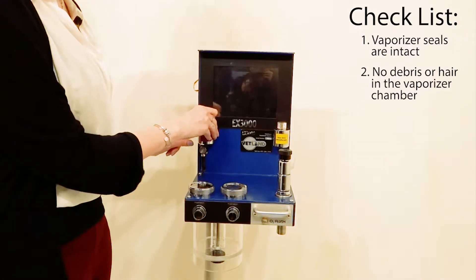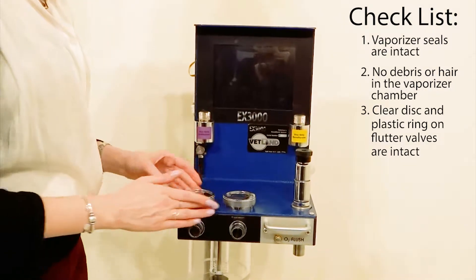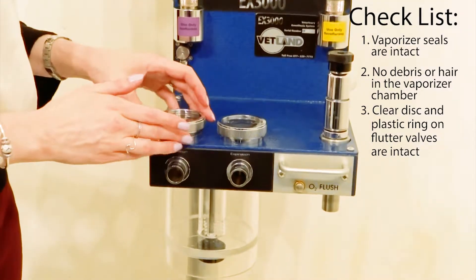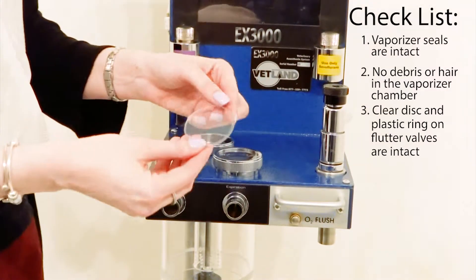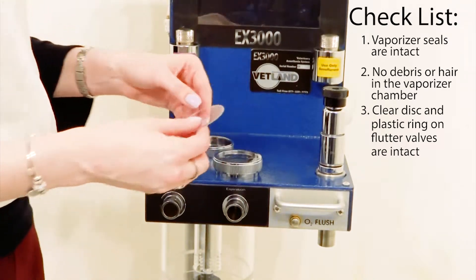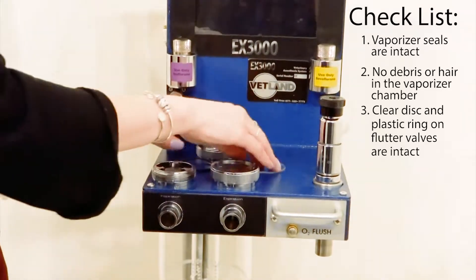Other common areas you can get leaks on this machine would be the flutter valves. You need to go ahead and unscrew both of these and check both parts. Check the clear plastic disc for integrity around the edges — sometimes you can get cracking — and make sure that you have the plastic ring and that it's intact as well.